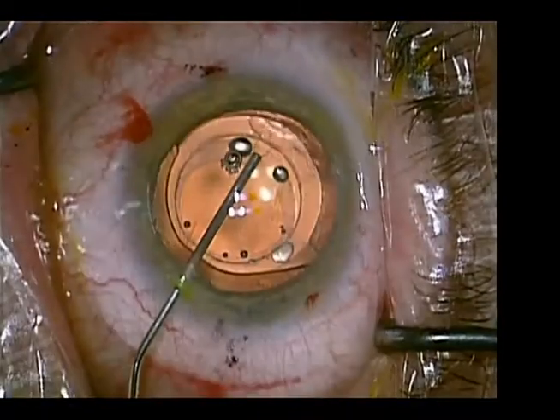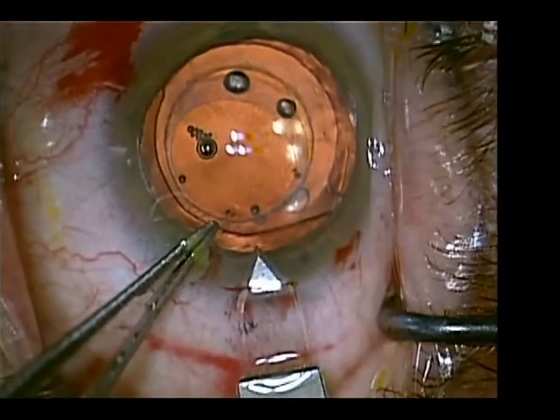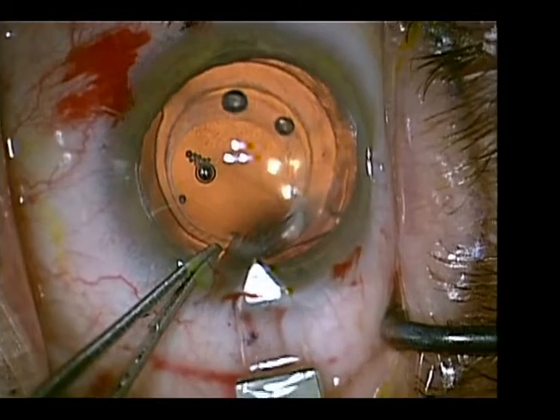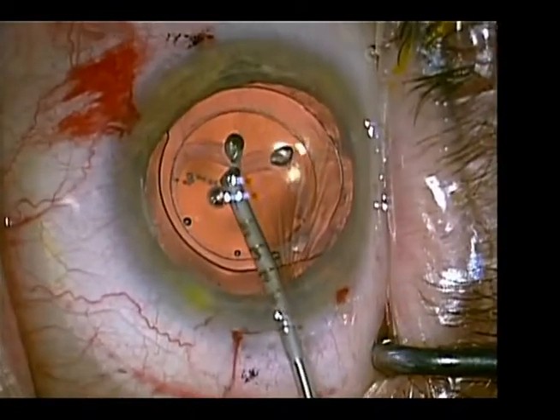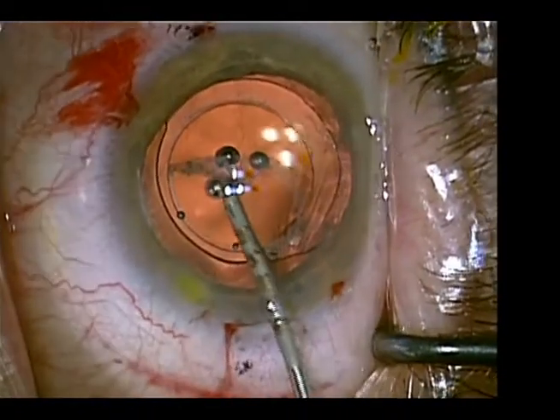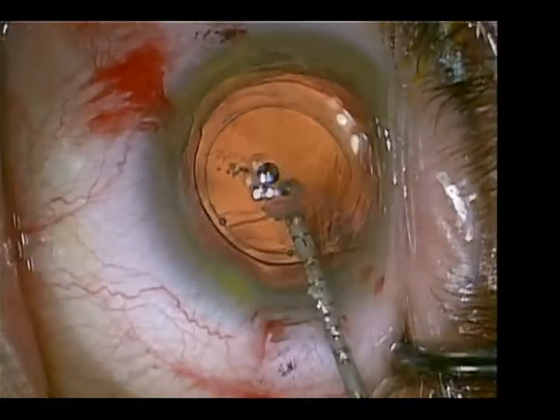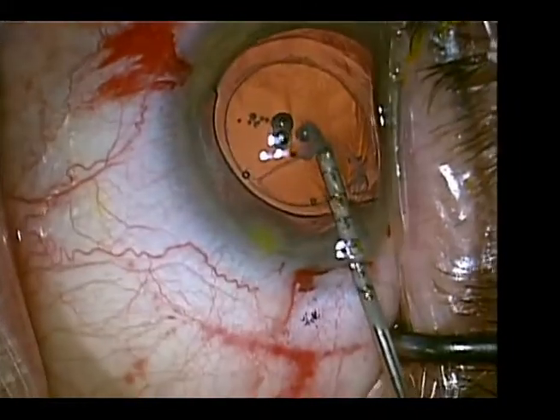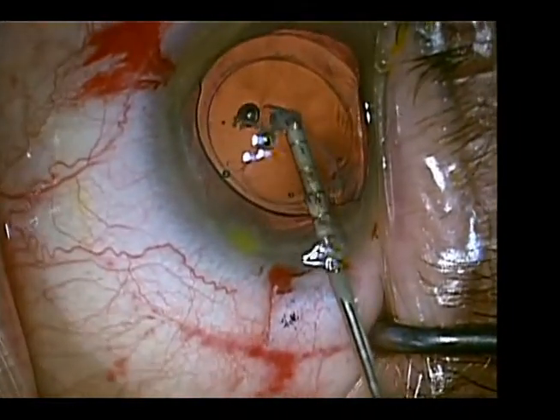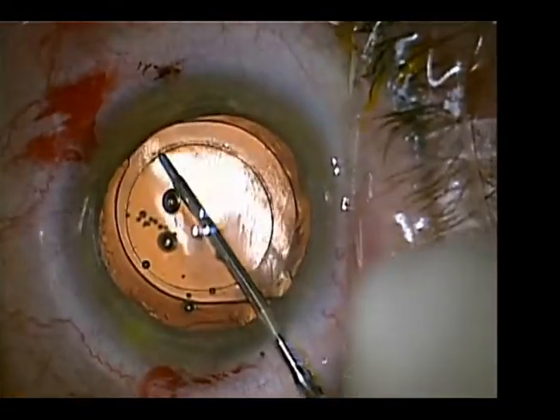In the operating room, under viscoagent, a 2.2 millimeter clear corneal temporal incision is created and micro forceps are used to free the laser cut anterior capsule edge.